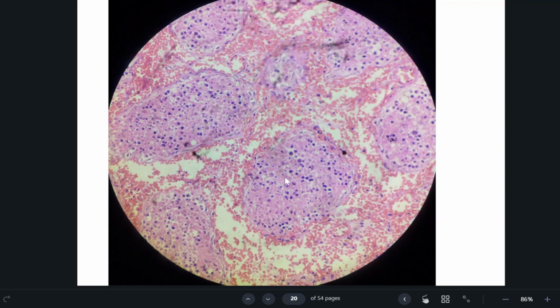And many are not showing a nucleus. Only the cell outline is there. No nucleus is there, only increased eosinophilic cytoplasm, no nucleus. So what happens to the nucleus in coagulative necrosis? There is pyknosis, nuclear condensation. Then karyorrhexis, nuclear fragmentation. Finally, karyolysis or dissolution of the nucleus.